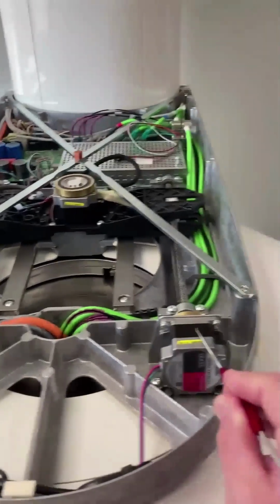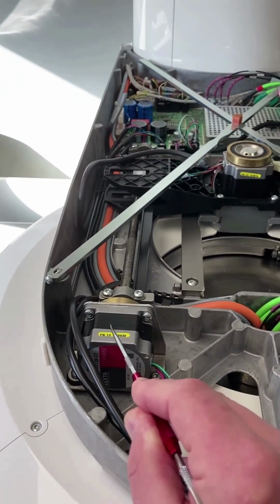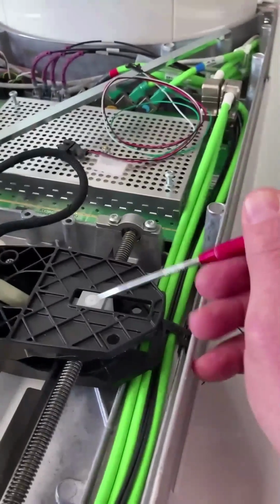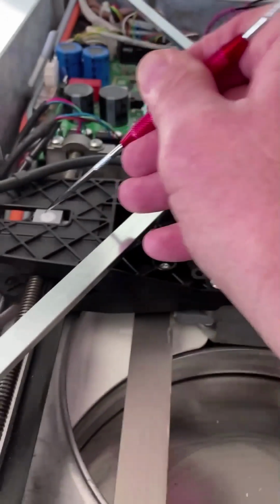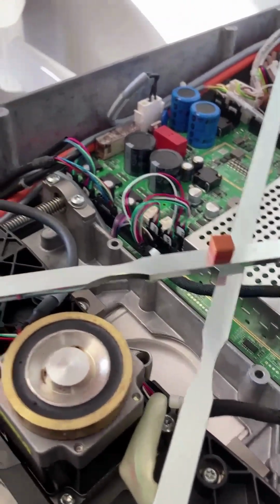So what in the world is going on with this pan? Well, if you'll notice, you've got two stepper motors, left side, right side, that drive this thing that I call the butterfly clamp. Now, I'm sure Sirona's got a better technical term for it than that, but inside this butterfly clamp is this thing called a light barrier. They're located on the left and right side, respectively, and right where the probe is pointing is where that light barrier is going to be located on the right and left side for each respective stepper. And so what we're going to do is go ahead and show you this light barrier.